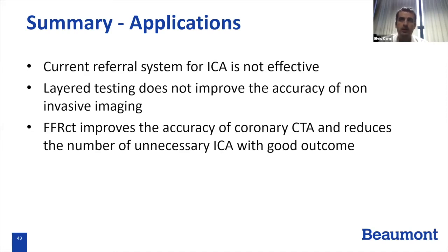So as you can imagine, because they have to see the lumen, right? When you send them the data set to HeartFlow, they have to model the lumen of the artery. So they still have to do that. And it can. There was a paper that was published by Bjarne Nørgaard, who's written a lot of research in CT.